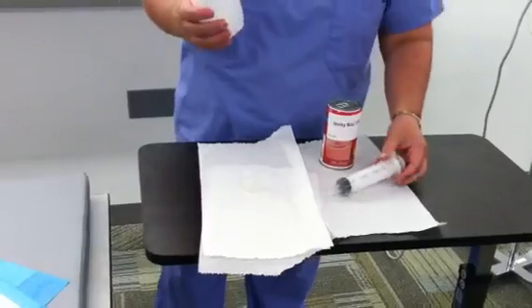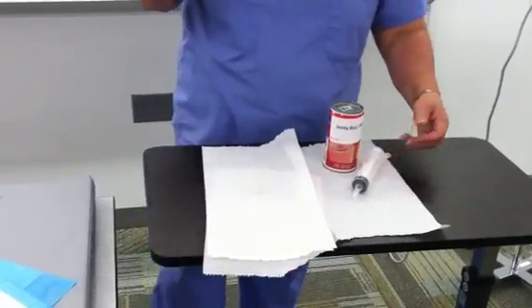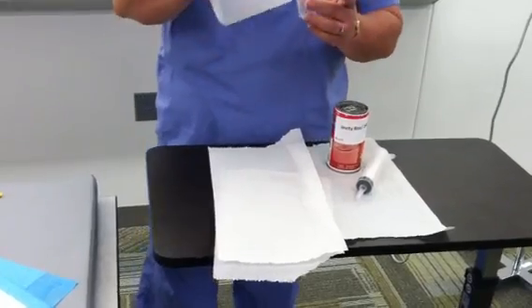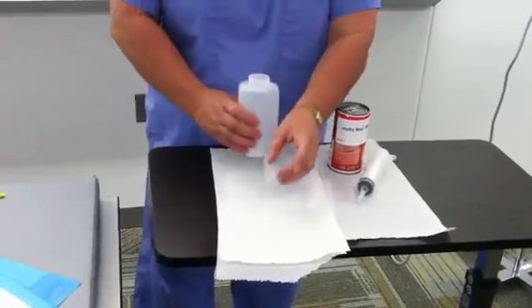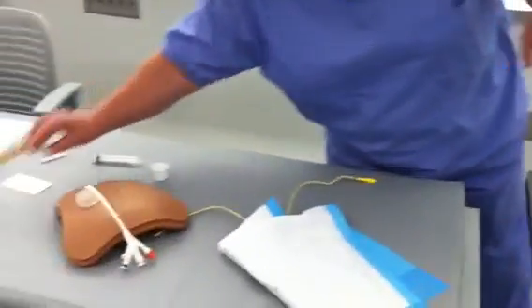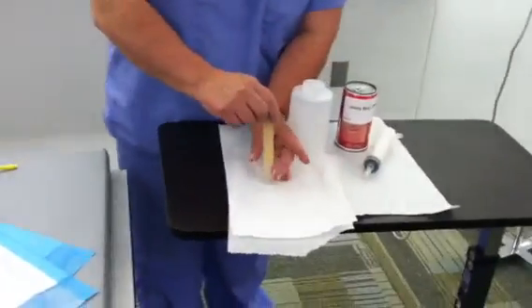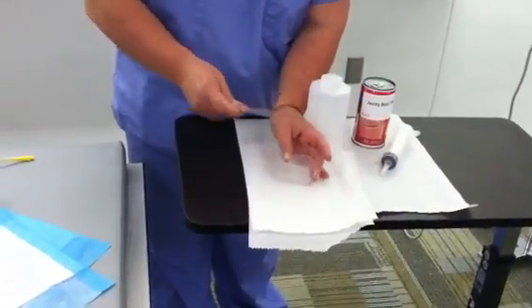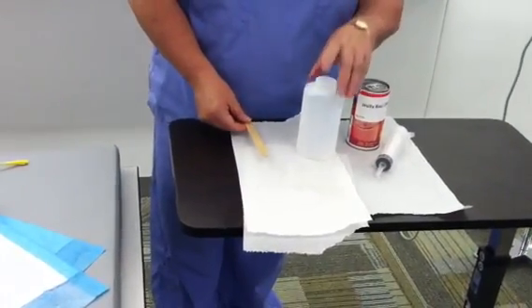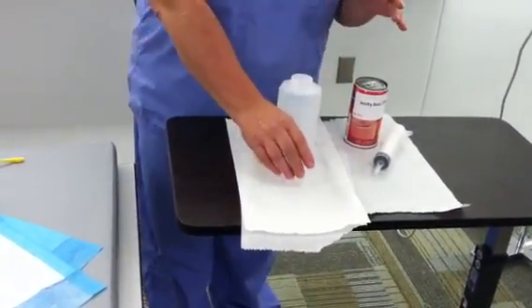Then the water should be kind of room temperature, or ideally even a little warmer, to mix with the medicines. I'm going to mix 20 to 30 mils of water with the medicine, and I'm going to stir it up with a tongue blade. And then I'm going to let that sit while I'm checking placement and checking patency so that the medicine has time to dissolve.